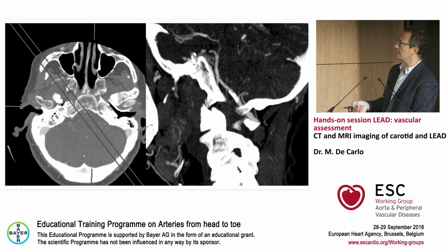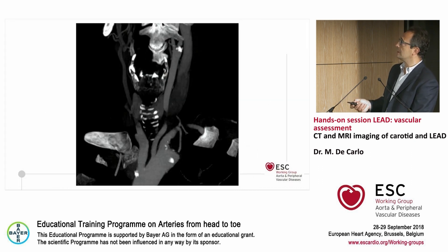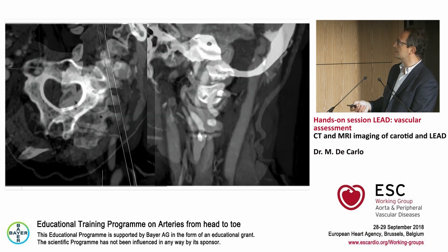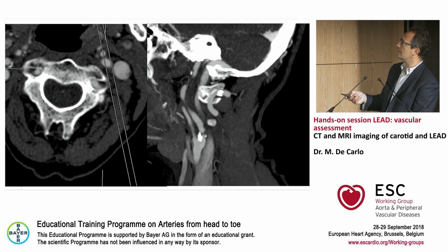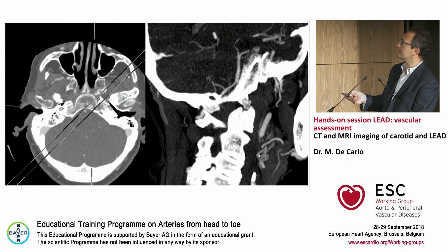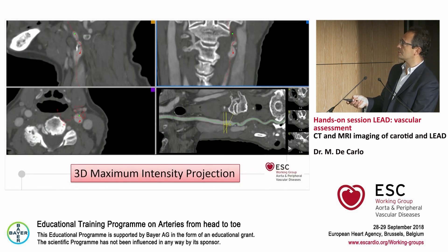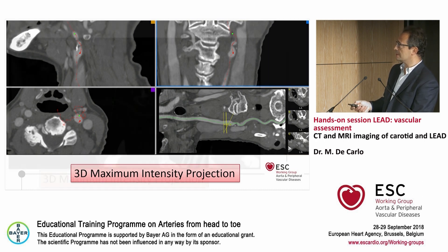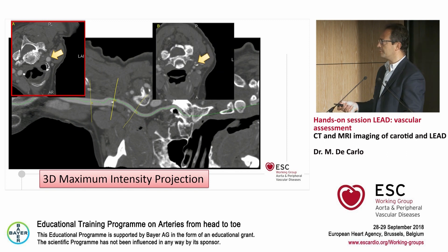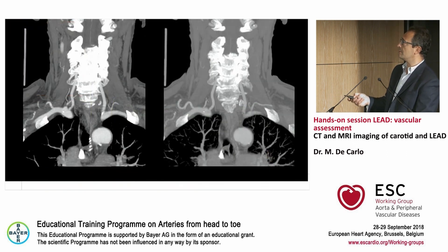You can reconstruct any longitudinal image starting from the baseline acquisition and see the intracranial internal carotid artery. You can appreciate the stenosis, noting that calcification actually overestimates the stenosis. You can follow the carotid artery all through the neck up to the brain and the intracranial portion of the internal carotid artery. You can reconstruct the entire artery and have all measurements along the full length from the common carotid to the internal carotid. This gives you a lot of information to plan your intervention very precisely, and you can also see the posterior circulation.